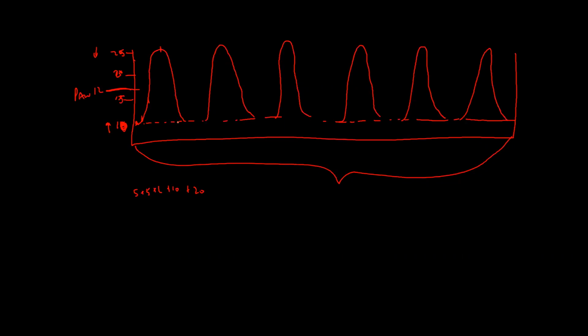But even when it's resting down here in exhalation, which is usually 2 times the amount of time as it's in inspiration, we're hitting 10 for all of those instead of 5. And then every time I go above that baseline, that's helping to increase the value of that mean airway pressure. All these lines that I'm putting in these breaths is showing you that it's increasing the mean airway pressure above what the PEEP value is.